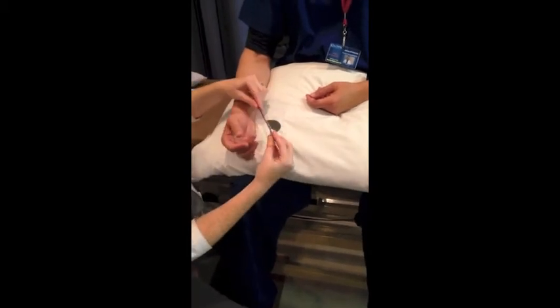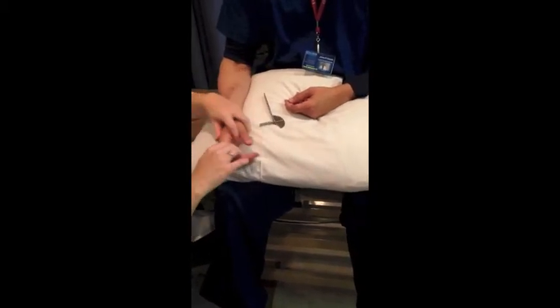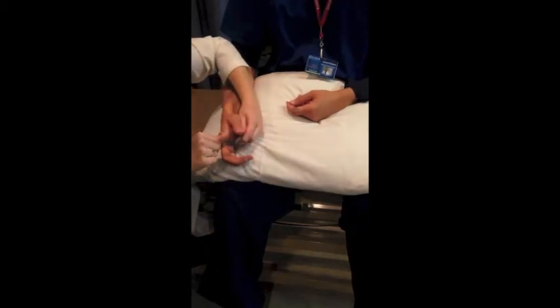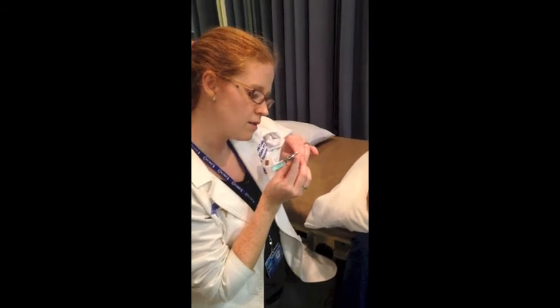Now we're going to flip around here to do extension — I thought that was just under 90. Notice how I have them in neutral to make it easier on myself. Let's supinate. And we have 65.